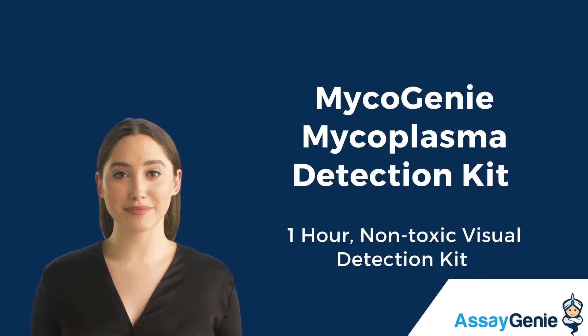Hi, I'm Becca from AssayGenie. Today, I'm going to talk to you about our mycoplasma detection kit that allows you to detect mycoplasma contamination in just one hour.